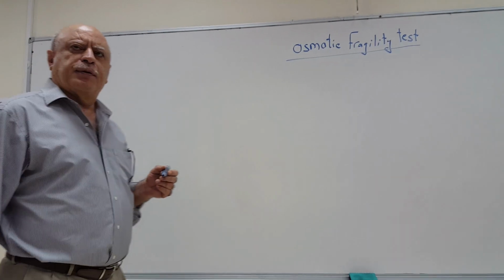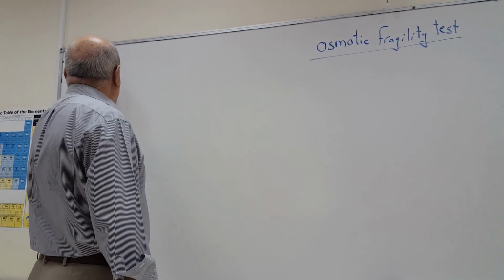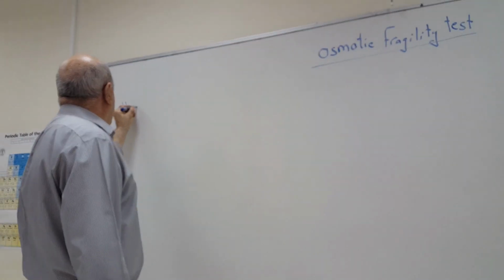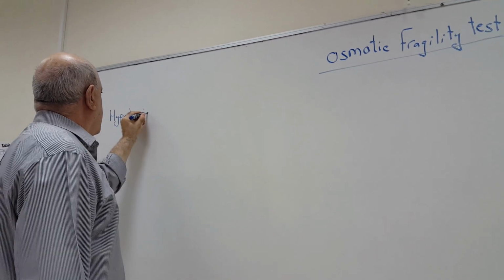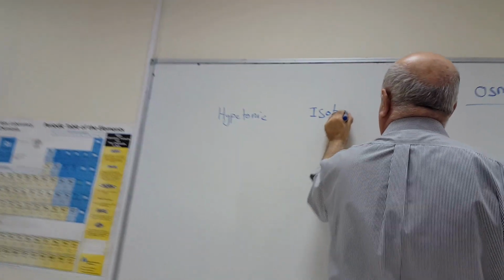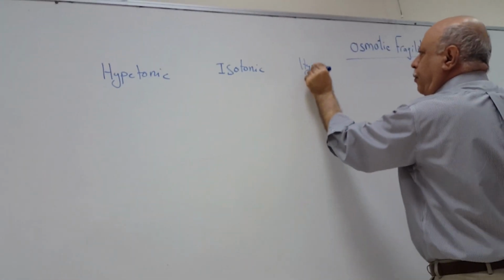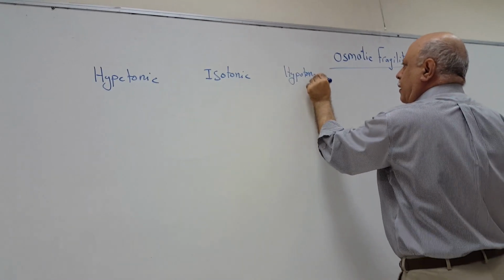Tonicity and three types of solution. In terms of tonicity, we have hypertonic solution, isotonic solution, and hypotonic solution.